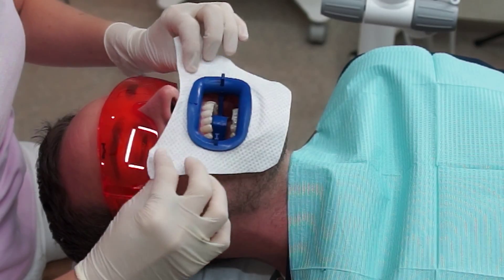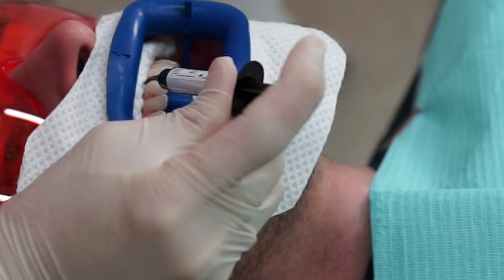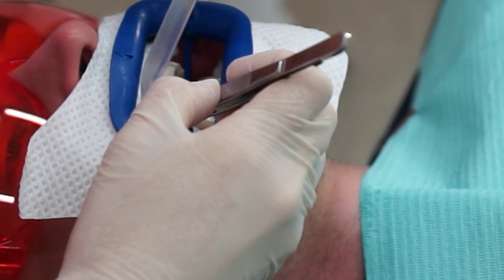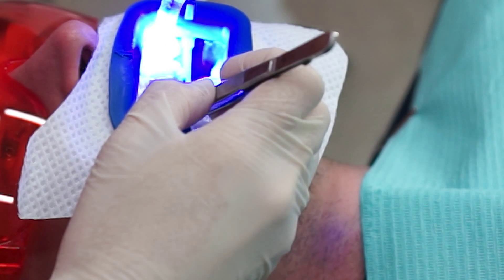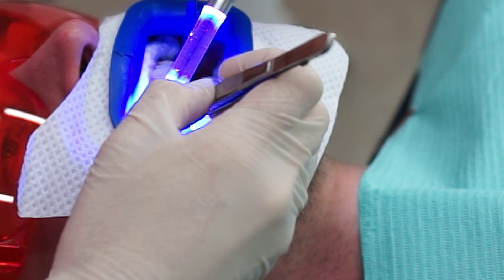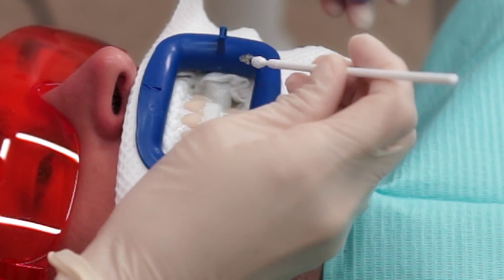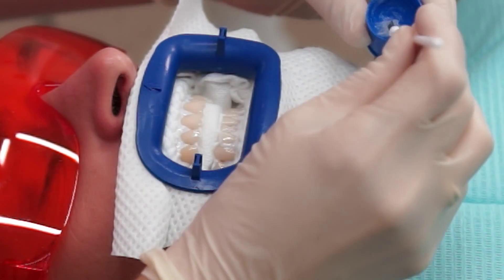The first part of the preparation is to isolate the soft tissue or the gums from the teeth, because in order for teeth to be whitened, a specific gel is applied on the enamel surface. This protective layer that protects the gums is to prevent the gums from becoming irritated. It is light cured so it becomes hard and stays in place during the course of the treatment. The papillae are protected properly so that the enamel surface of the teeth is the only thing exposed for the whitening procedure.